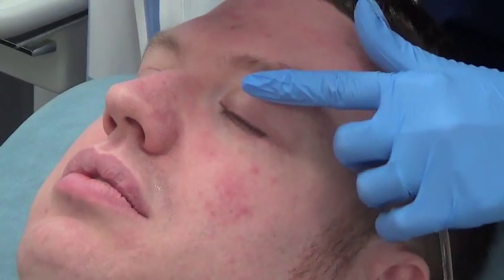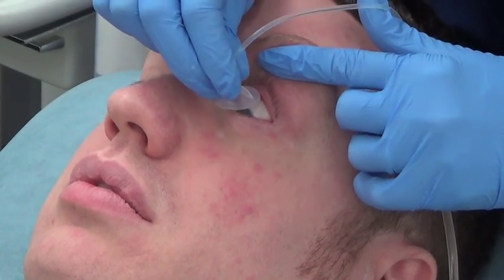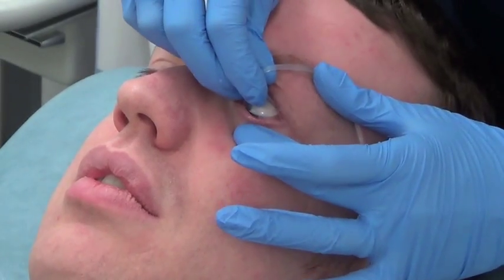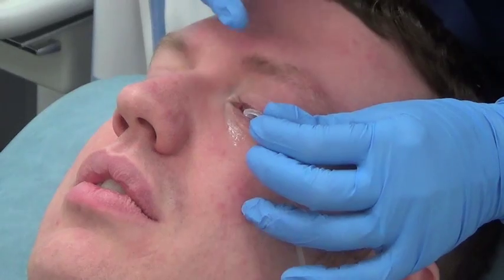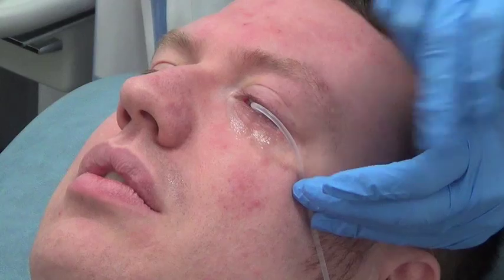Ask the patient to look down while firmly lifting the upper lid. Insert the lens under the upper lid, then retract the lower lid down and insert the lens in place. The patient will naturally close their eyes around the Morgan's lens and now it's ready for irrigation.